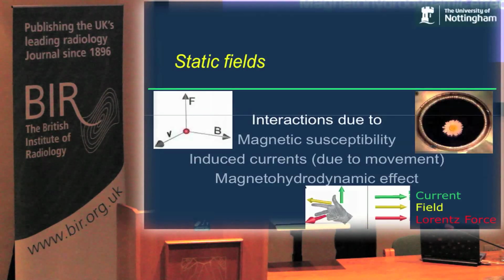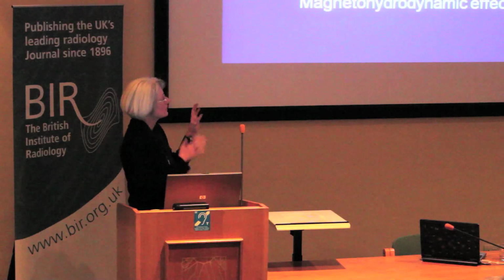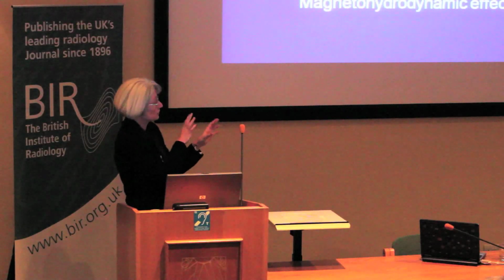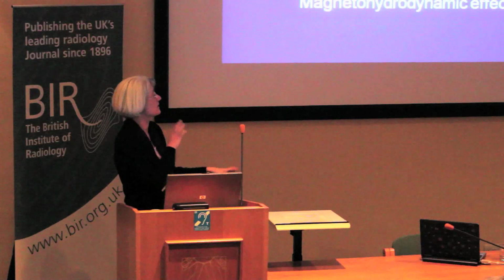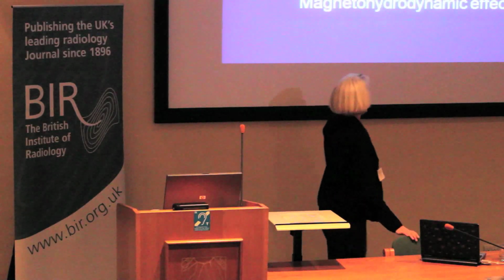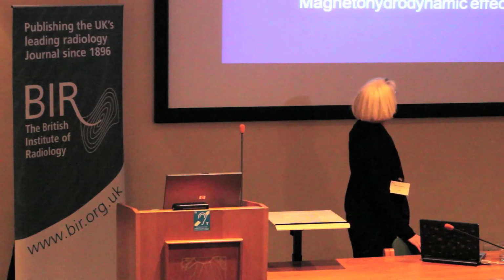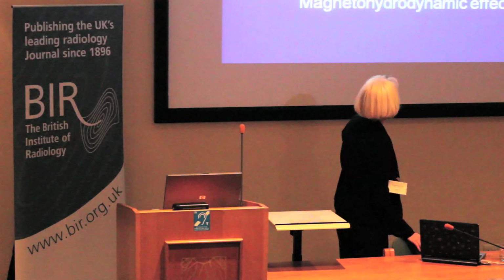In fact, this is a daisy that's being levitated above a magnet, rather similar to an MR magnet, but with a much stronger variation in magnetic field. And so all the objects, as they go into the magnet, all human bodies, if they go into the magnet, are actually being slightly repelled by it in exactly the same way as the iron's being sucked in. So that's the first effect. And I'm going to show an effect that this actually has in cellular development later on.